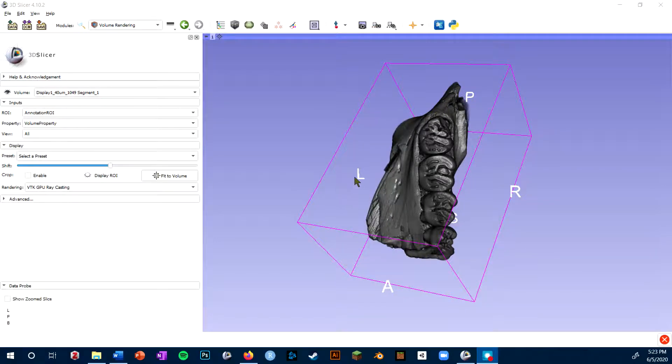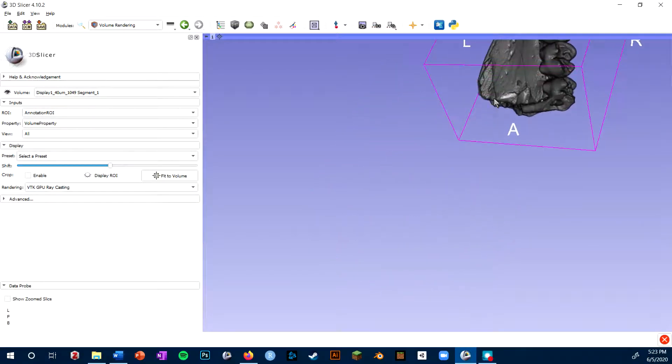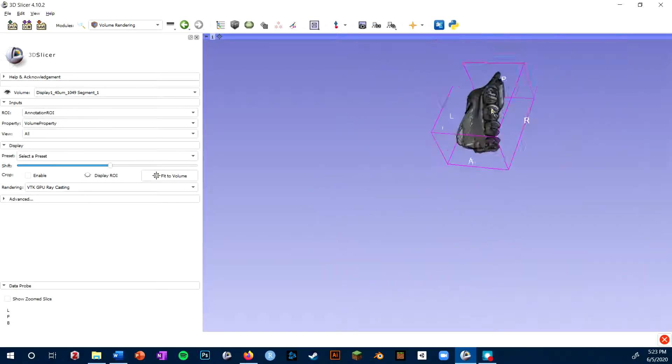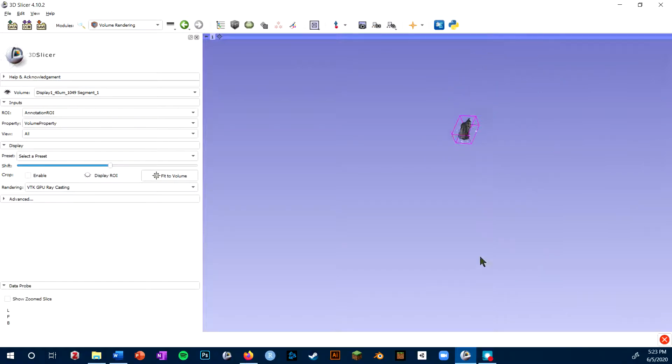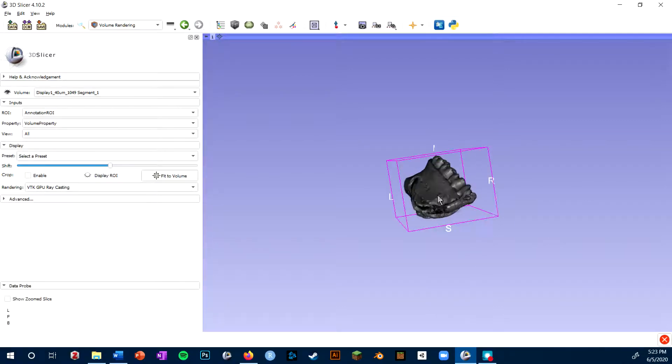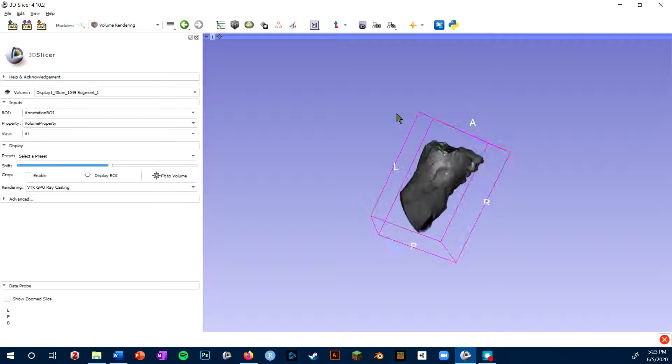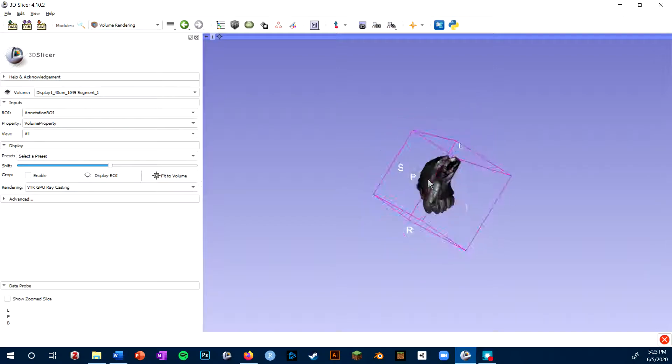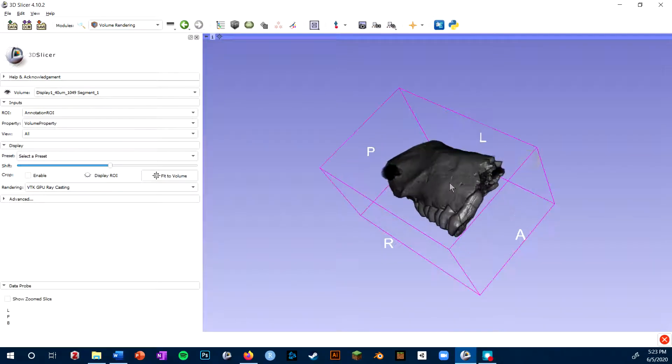A useful trick to note is that if you get completely off-centered from your volume such as this and you need to recenter it, you can just click this little button in the upper left. It may still be a little zoomed out, but once I zoom in I'm completely centered on my specimen.